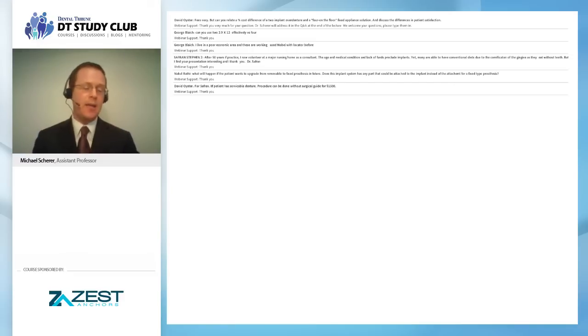And in fact, if the implant goes down, so if this is your Zest LODI implant and you're down into the soft tissue, looking something like this, and you're torquing right now at 20, 25 Newton centimeters, I recommend backing out that implant, going in with a wider osteotomy, and then replacing the implant so it goes all the way down into place. So I definitely don't recommend cranking too much, but again, I direct you to the surgical videos that are present on the YouTube channel.